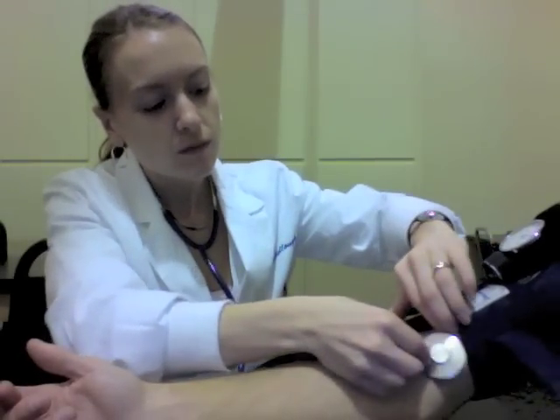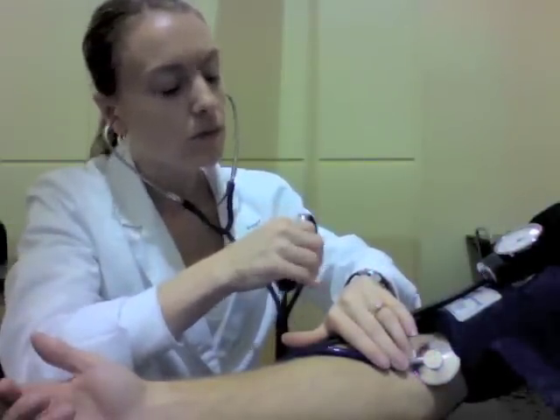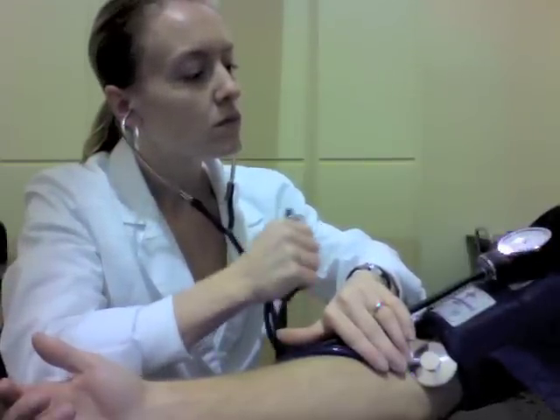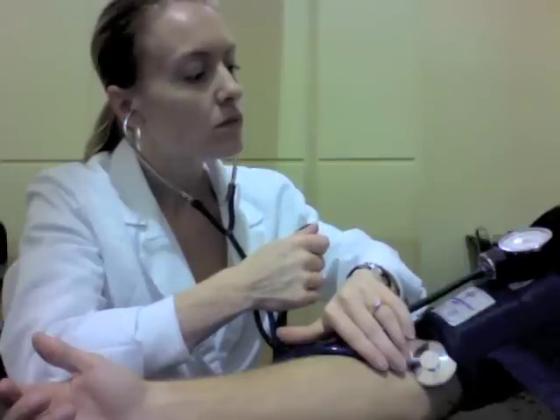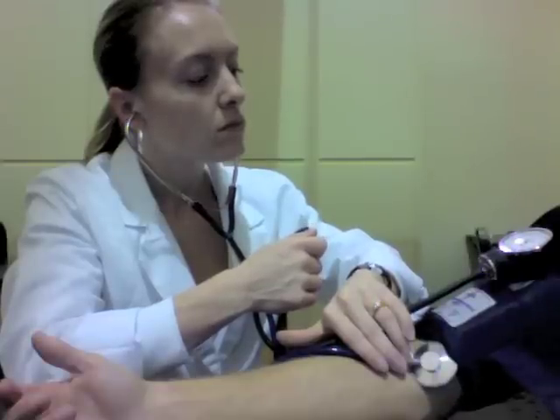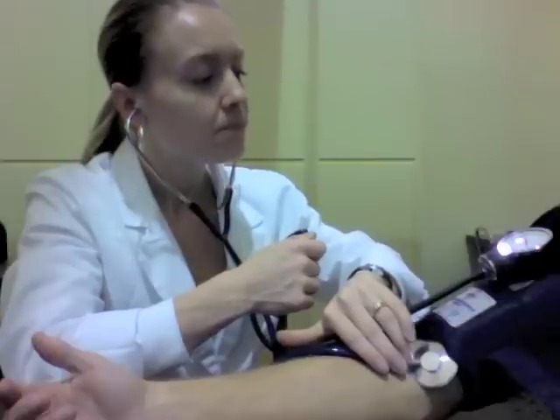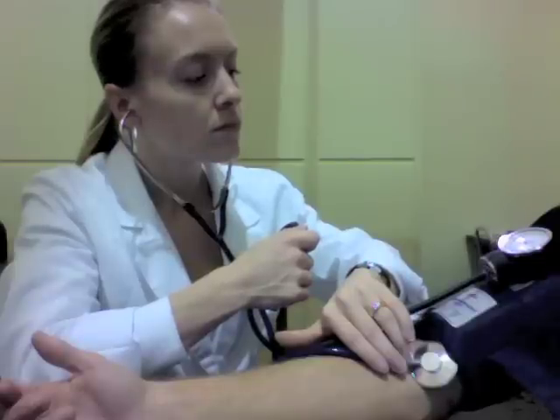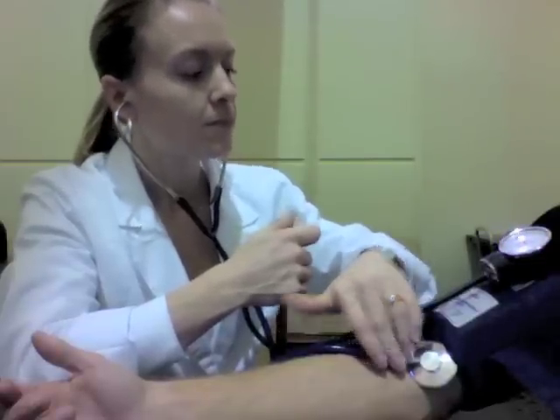The auscultatory method of determining flow is pivotal to accurate blood pressure reading, and that is why practitioners use a stethoscope. The stethoscope is used so the observer can hear the blood gradually pumping its way back through the artery. There are 5 phases in the Korotkoff auscultatory method. Phase 1 refers to the first appearance of clear, repetitive tapping sounds. This coincides most accurately with systolic pressure. Phase 2 sounds are softer and longer, whereas Phase 3 sounds become crisper and louder. At Phase 4, the sounds become muffled and less distinct, and Phase 5 marks the time where no more sounds are heard. This, although debated, coincides most accurately with diastolic pressure.